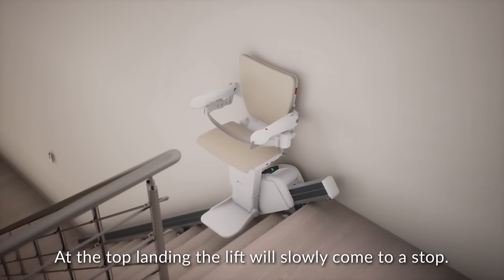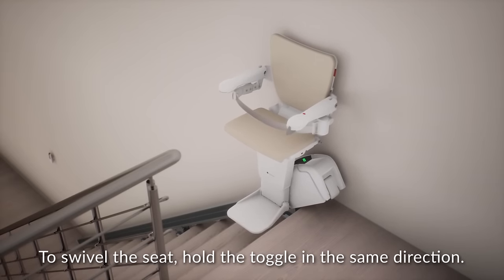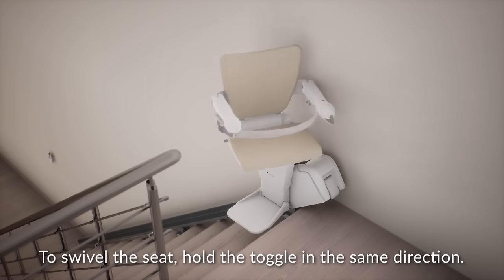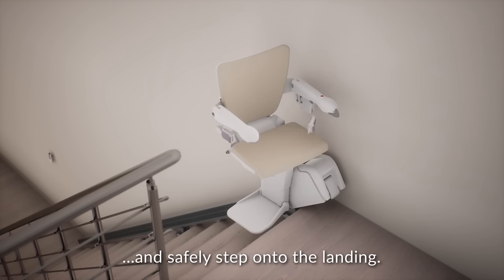At the top landing, the lift will slowly come to a stop. To swivel the seat, hold the toggle in the same direction. You can now unbuckle the seatbelt and safely step onto the landing.